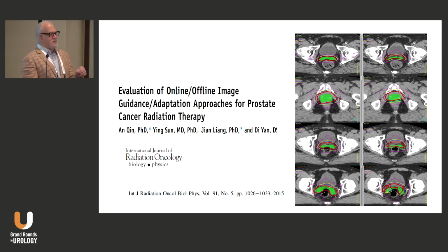If you have markers in the prostate, if it's radioactive seeds that you're combining with it, or the fiducial markers, it is very easy to match up and see the changes. Now, you can then make changes. You can move that whole field up and down by millimeters and get very close to perfection. Is it perfection? No. Can adaptive therapy make a difference?